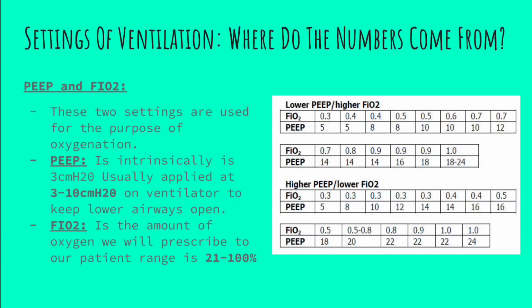When we're thinking about adding PEEP, you'll hear some people say to use an approach called the ZEEP approach for certain patients, particularly patients that have conditions like asthma or COPD, where there's already an air trapping type of phenomenon. But in most cases, this is not really going to be very helpful for you because you're not going to be able to keep those airways open well enough to let that gas escape.